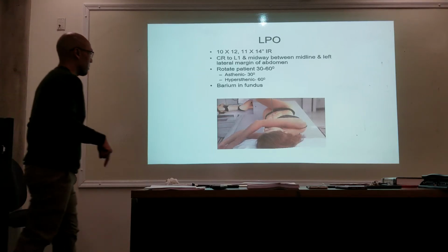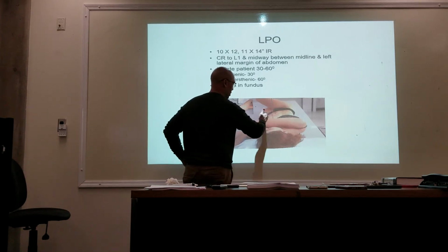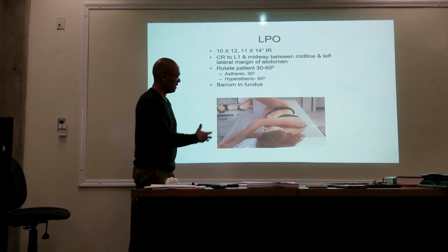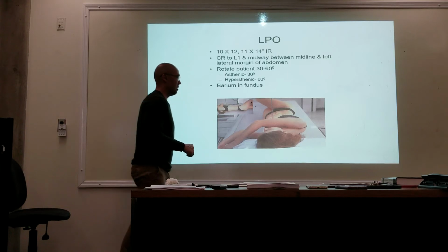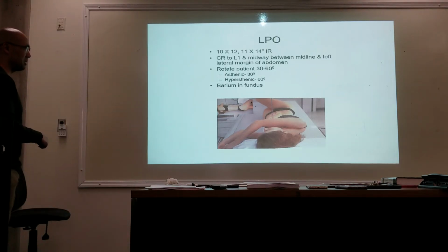And so once you get the level of L1, now you're going to center slightly to the left of the mid-sagittal plane. Okay, because where's the stomach? It's on the left side. So you're going to center slightly to the left of the mid-sagittal plane. At the level of L1.